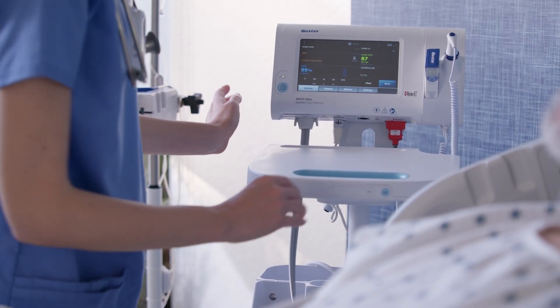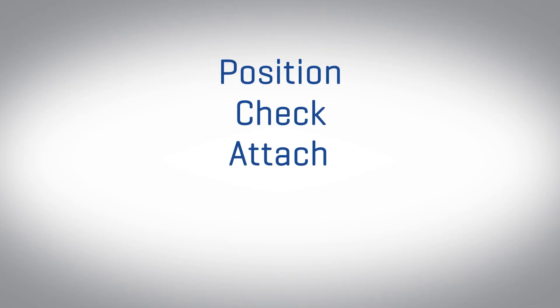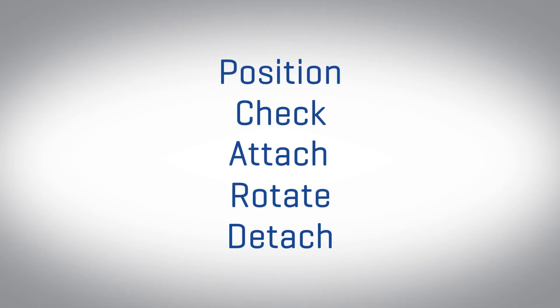To apply a Welch Allen FlexiPort cuff, utilize this five-step process: position, check, attach, rotate, and detach. Let's go into each of these in a little more detail.